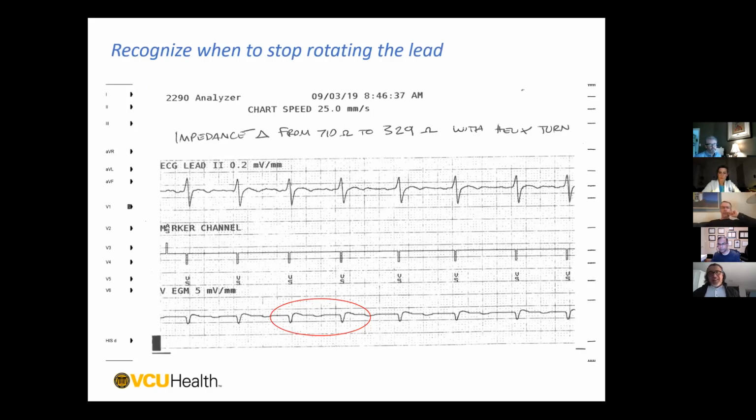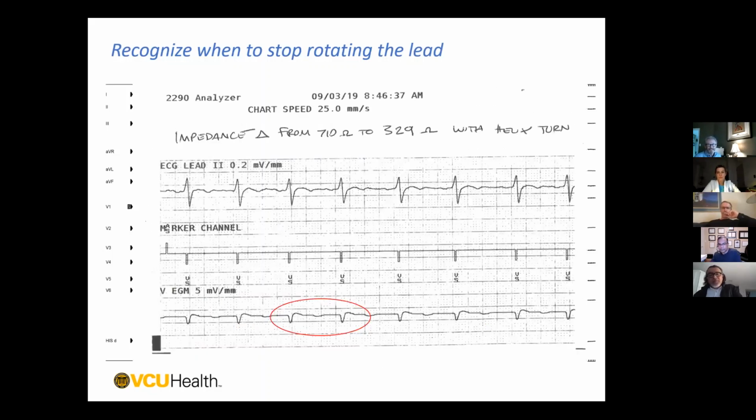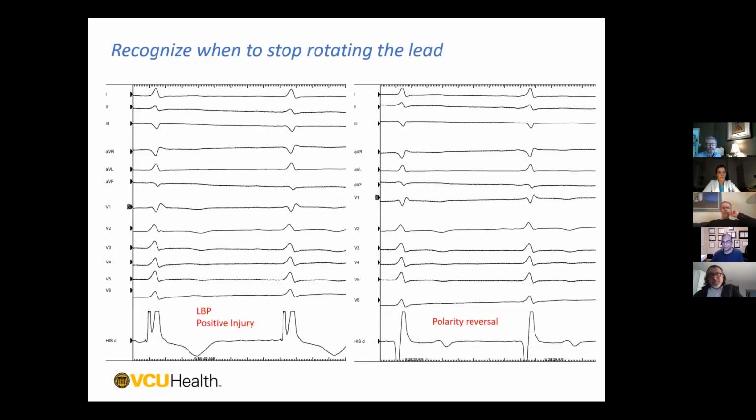You're through? You know what? I will then check what the threshold is unipolar. I'll see what the impedance does, and often the impedance has dropped by 10 to 15%, but it's pacing fine and the threshold's good. When I go through, and I've done it, I find that the impedance goes right off. It just doesn't capture anymore, unipolar.